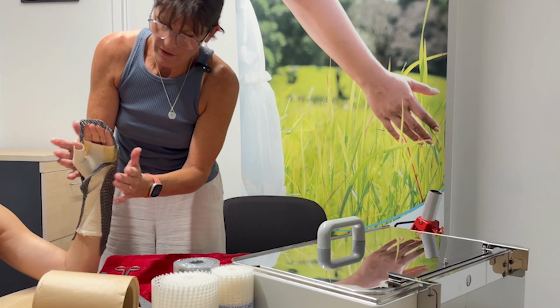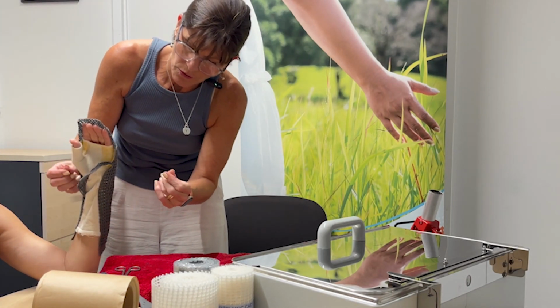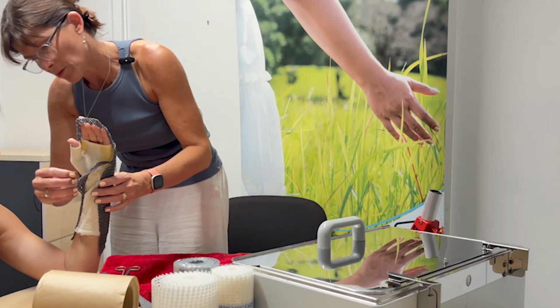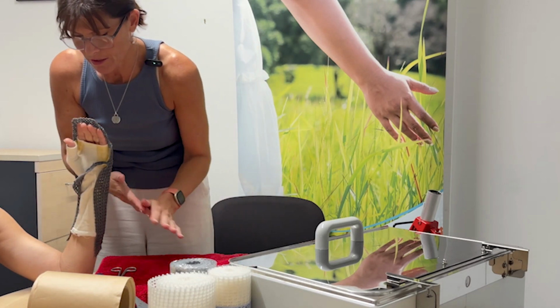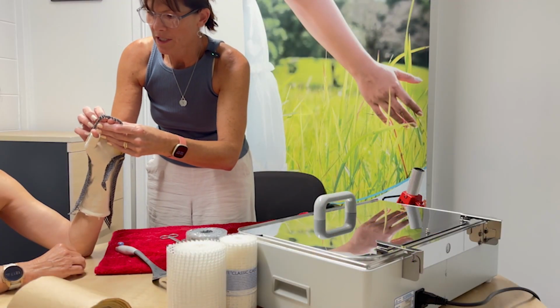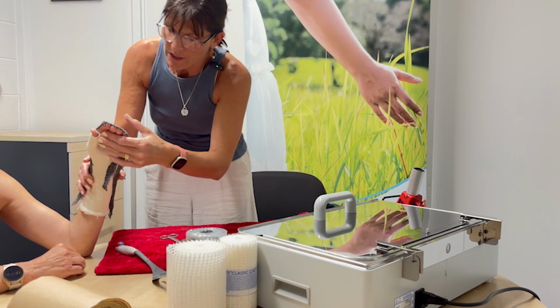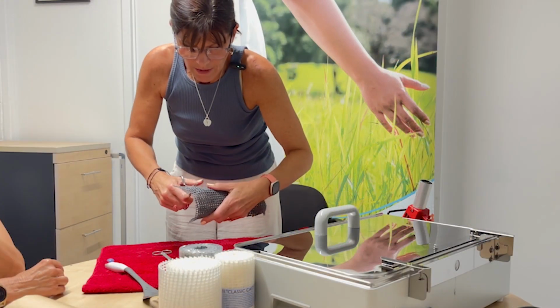I'm going to cut the rest of it off the patient because I don't want to do it while it's on there. You can take your crayon pencil and just mark where you want to cut, and then come back and cut it with scissors once it's cool. So now when that material has gone hard, you can remove it and make the cuts.